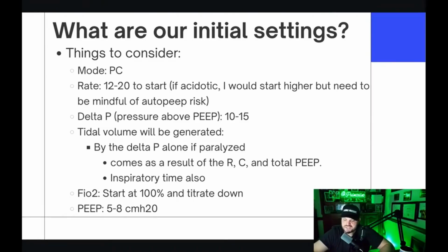And if the patient gets more bronchospastic, that delta P of 15 is only going to get you 400 now. So your minute ventilation is going to fall off. If your minute ventilation falls off and your alarms aren't tight, meaning your minute ventilation went from 5 to 3.1, but the vent would alarm if it was at 3, then your vent's not going to alarm. If nobody notices it, then the patient could be hypoventilated, right? Especially if they're paralyzed.